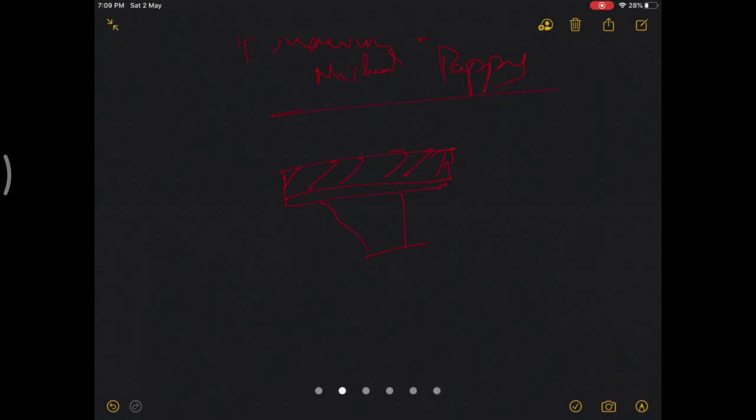So they started with something called the low contact stress, or meniscal bearing, or mobile bearing model, which has a flat base with a peg or a hole, on which the poly sits freely with its peg inside, and this allows free rotation of the poly.